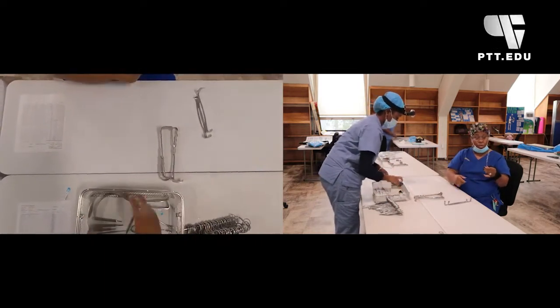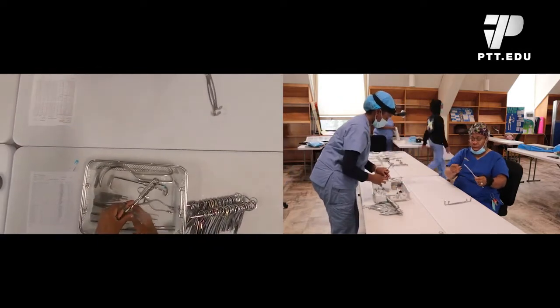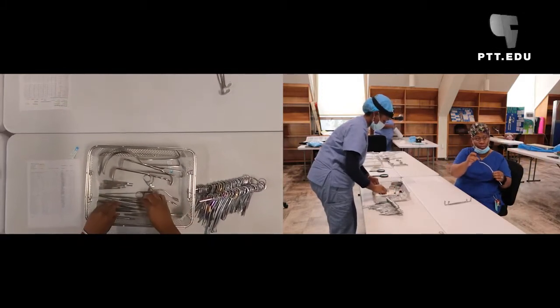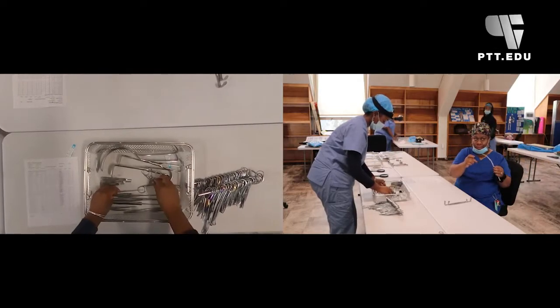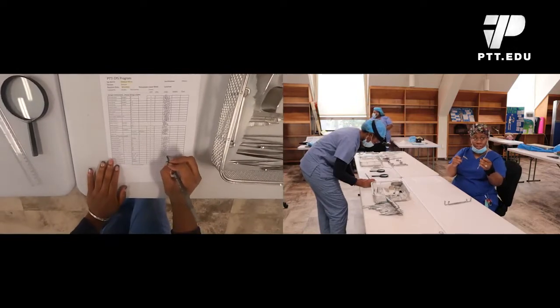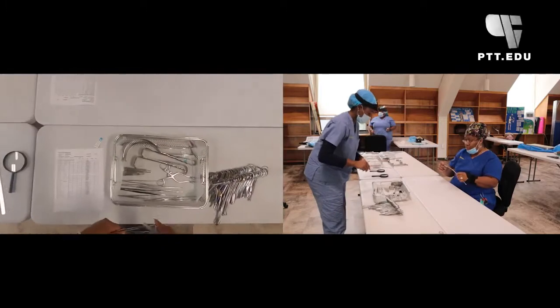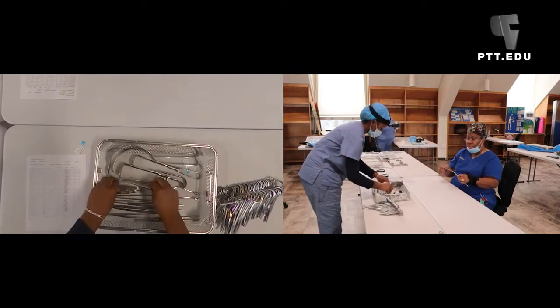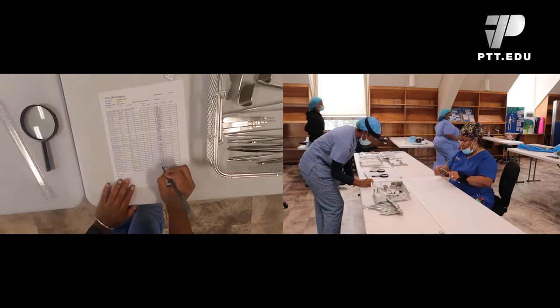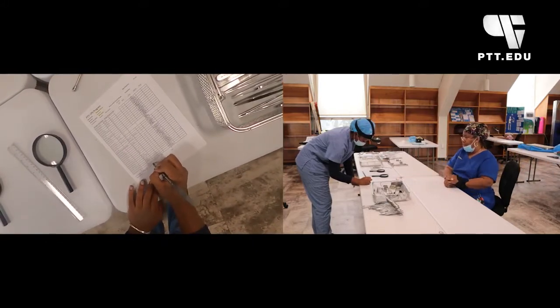It's actually screwed on. So when this was in decon, it had to be disassembled. Because can you imagine what was left in here and then what's left around the screw part? So we have to pay attention to detail. Because if we leave things unchecked, it can cause an infection inside of the patient, and that is not what we want to do. We always go for patient safety first. And I'm going to put this back on for her, and I'm going to hand that to her.